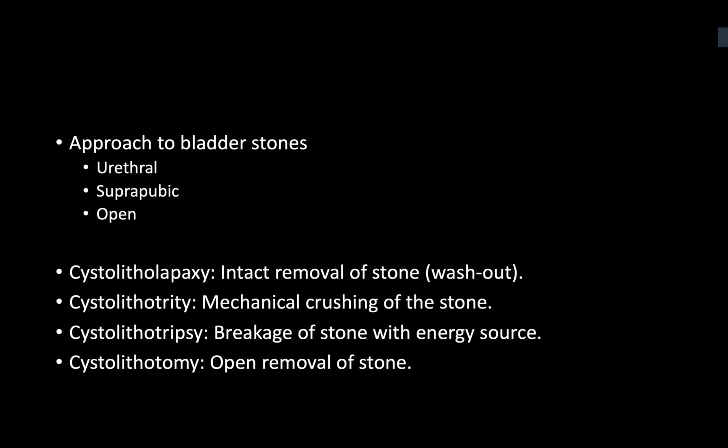And you spoke about the approaches that you counsel him for the treatment of his 2 centimeter bladder stone. What do you mean by cystolithotripsy? This could be using other forms of fragmentation other than laser, and this, for example, includes pneumatic lithotripsy, electrohydraulic lithotripsy, or ultrasound lithotripsy.